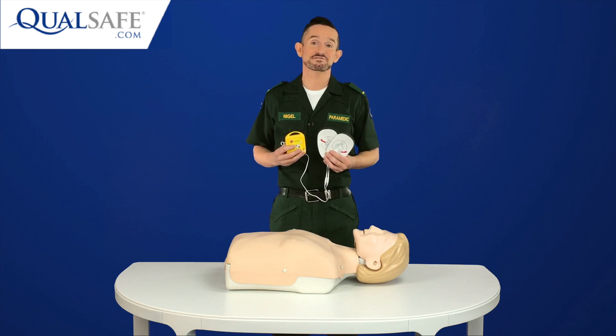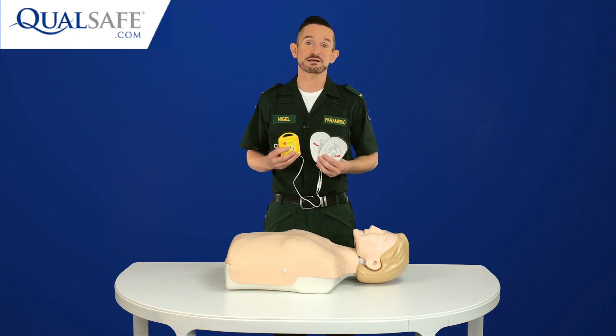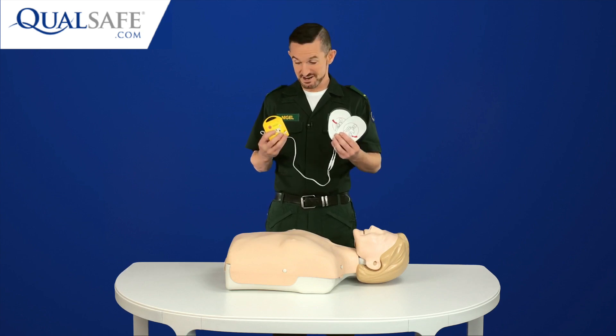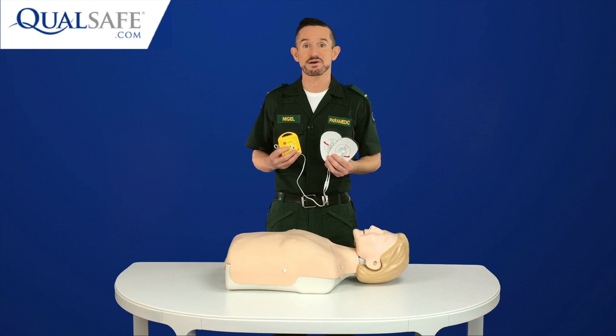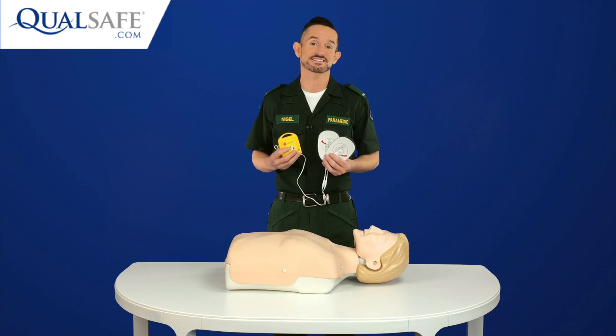Hi, my name is Nigel from Qualsafe.com and I'm really excited to be able to demonstrate for you the new Mini AED Trainer. At over £100 less expensive than any other AED Trainer on the market, it provides a solution that enables every learner on a first aid course to practice using an AED without breaking the bank.